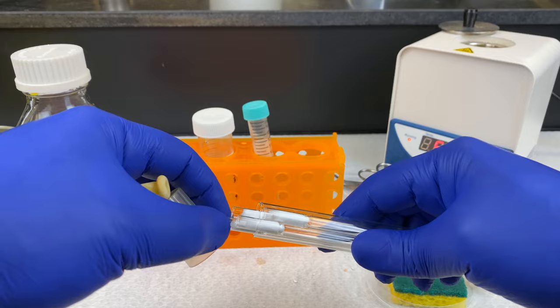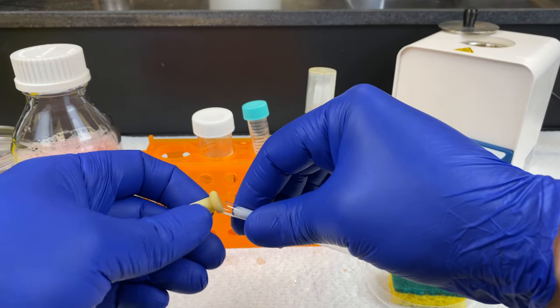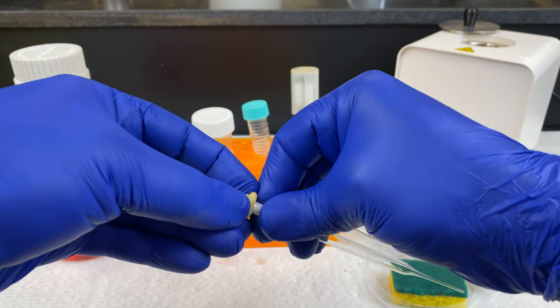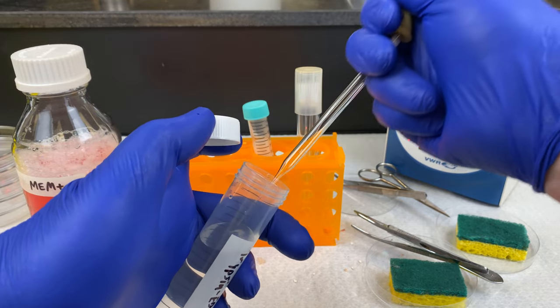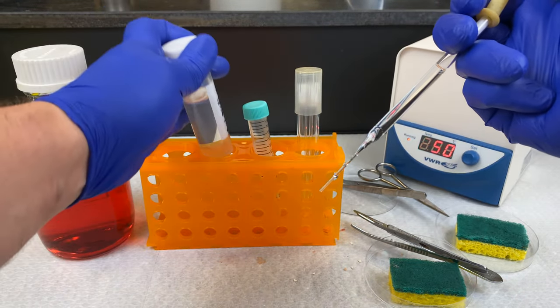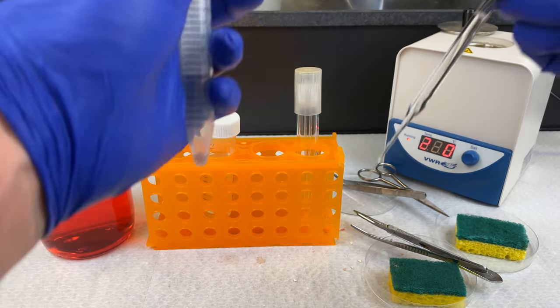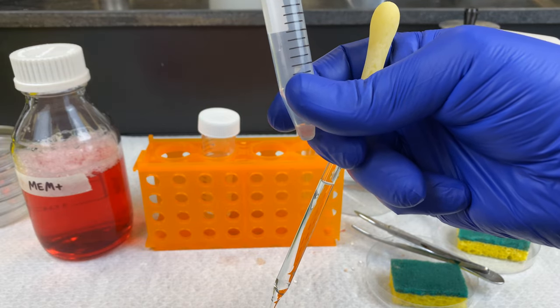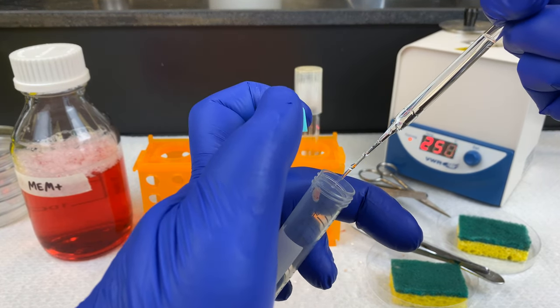We'll use a Pasteur pipette to add in the trypsin. Please note, we do not need to fill this entire tube with trypsin — that would be a waste of our resources. All we need is enough trypsin that the tissue is covered in it. Make sure you don't drop your cap, and also make sure that all the tissue is found in the bottom of the tube.